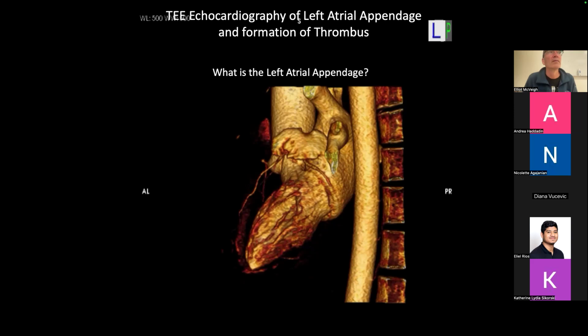Previous time you said there's a blood clot, then even if you defibrillate the person, you don't really know the cause for the clot in the first place, right? What if it happens again? Oh, okay. That's a great question. So let's say we have a true positive clot in the left atrial appendage, and we put the person on drugs. Then they come back, we do a spectacular job imaging their left atrial appendage, nothing in there. We say, fantastic. They go upstairs, defibrillate them, and then an hour later they have a stroke. It didn't necessarily come from the left atrial appendage. It could have come from many other places.